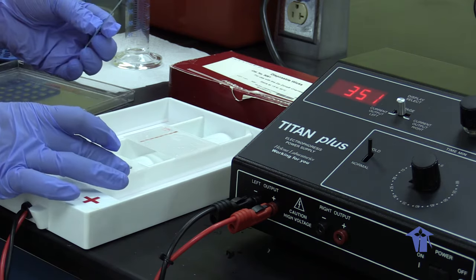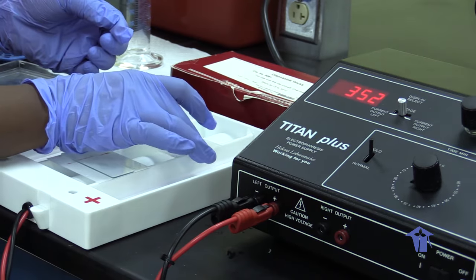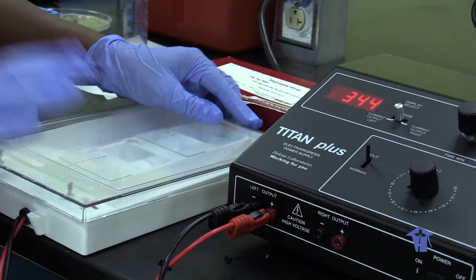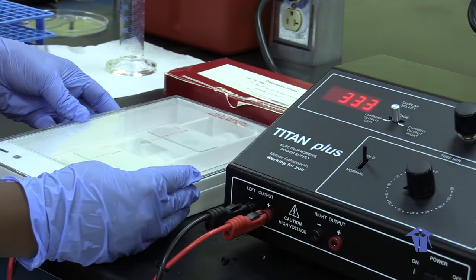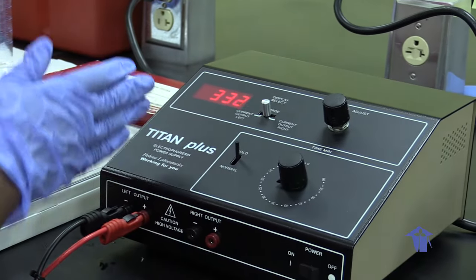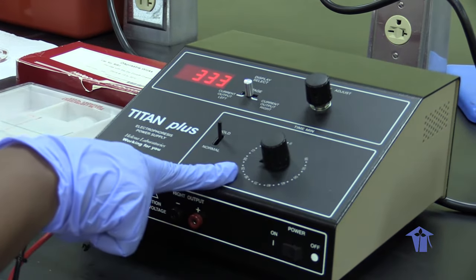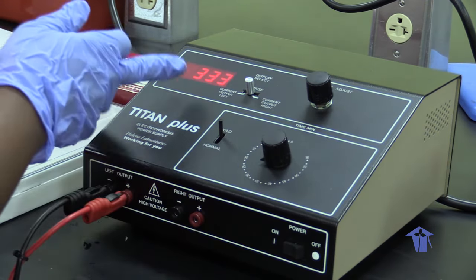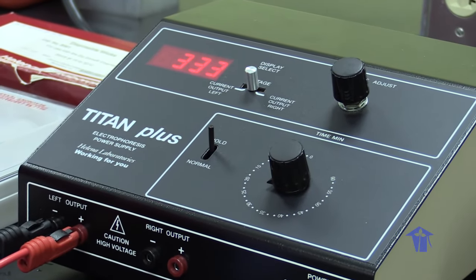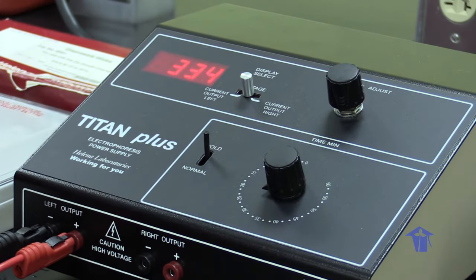Then it's just a technique I like to do: put the slides on top as an anchor. Close. And then we set. The manual instruction says that we adjust the voltage to 350 for 25 minutes. That's basically the machine settling to get to the correct voltage. And then we leave this for 25 minutes. Then we go on to staining.